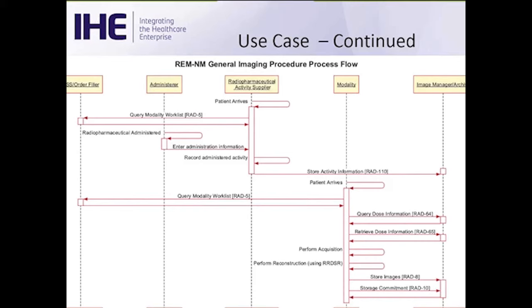So now we're into this period of uptake. The patient for PET systems may be in a room that's dim light, to reduce the stress on the patient, which may affect their studies. The camera is being prepped, collimator could be set, patient's finished. So their uptake time is finished. The patient arrives at the modality. The technologist, again, queries a worklist for the modality, so it has the patient's demographics.